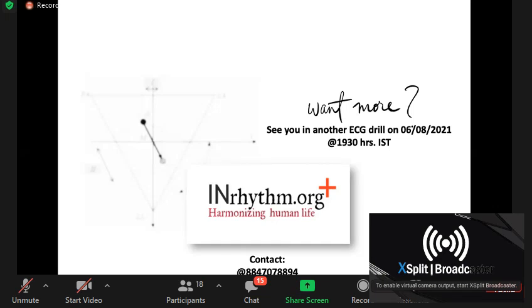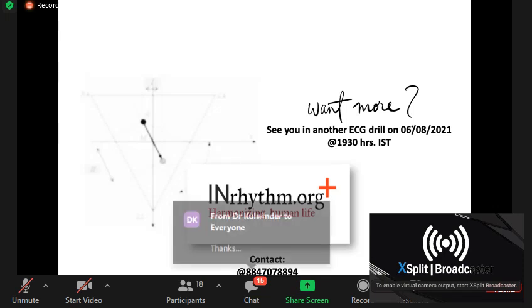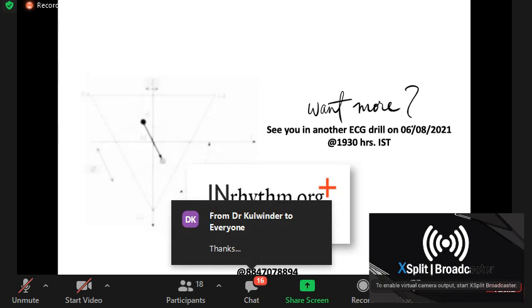So in your diagnosis, you write that the patient has chronotropic incompetence with sick sinus disease, and we put a pacemaker. And for sick sinus, because there is a remote possibility of AV nodal disease also, it is always better to put a dual chamber pacemaker. So these are some comments from the stressings actually.